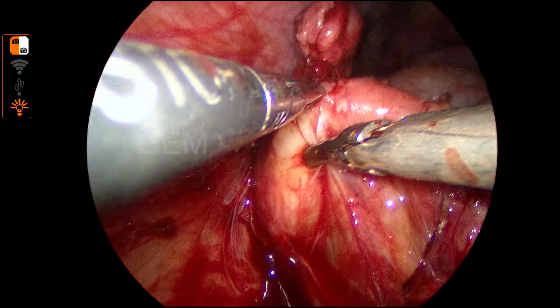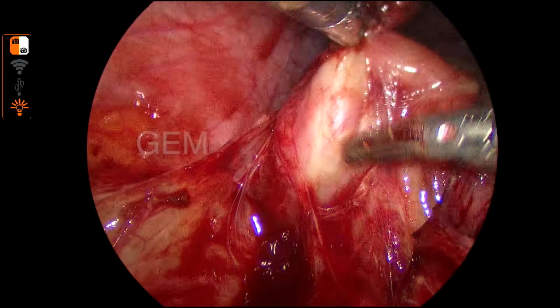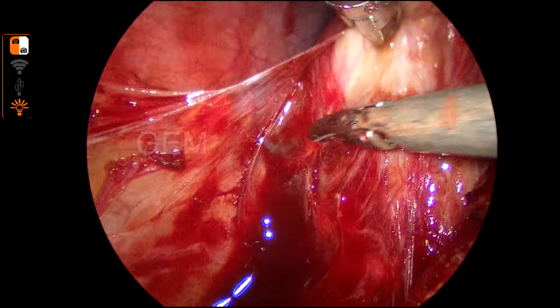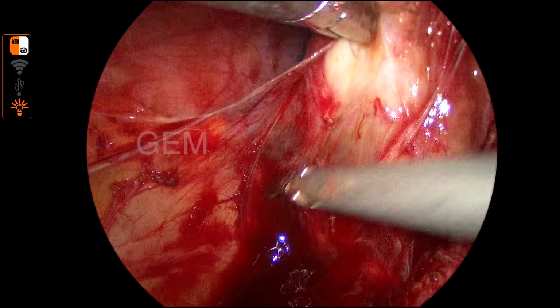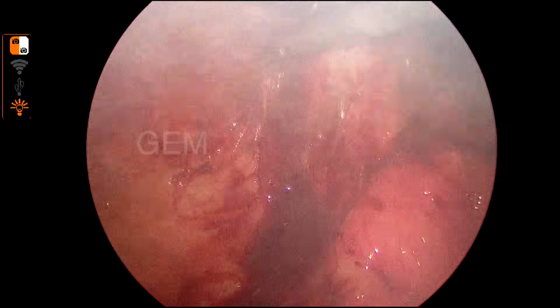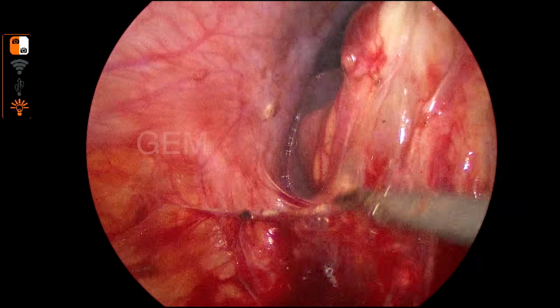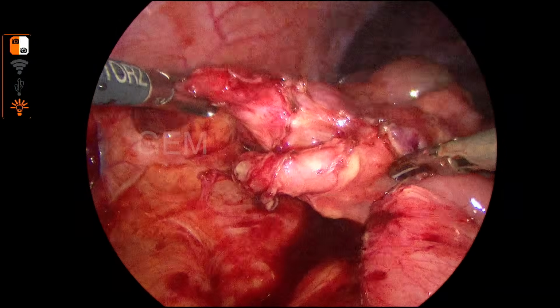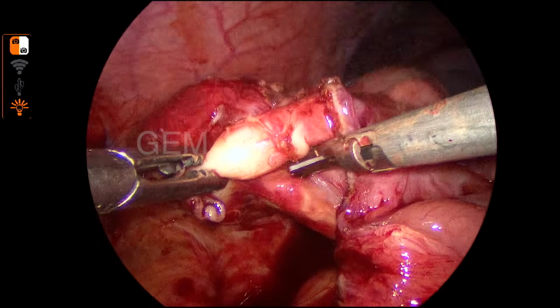So now I started dividing the mesoappendix. I try to mobilize the structure, but it is not able to separate. See, now again I am separating the retroperitoneal plane. I am separating, push the plane down, tissue down, so that the entire appendix is in my view. You can see now that lateral side also reached. So it's posteriorly and laterally mobilized, cecum and the part of ascending colon.